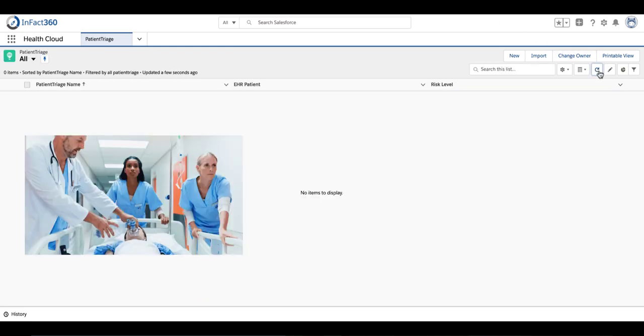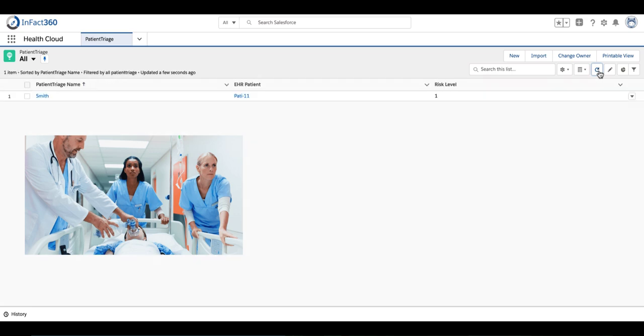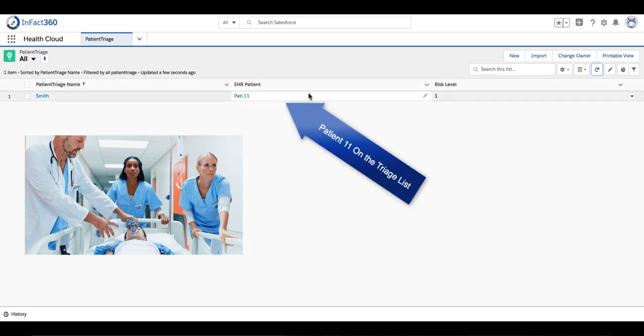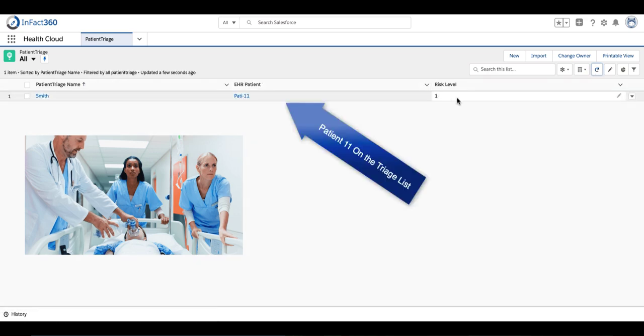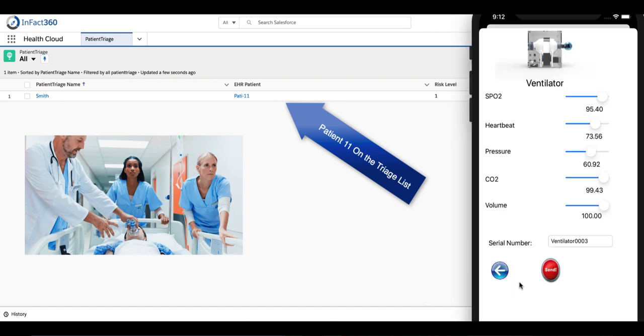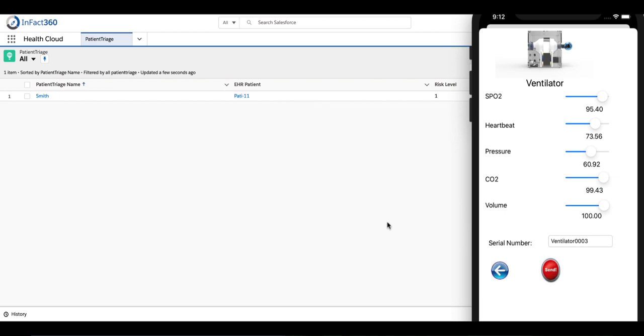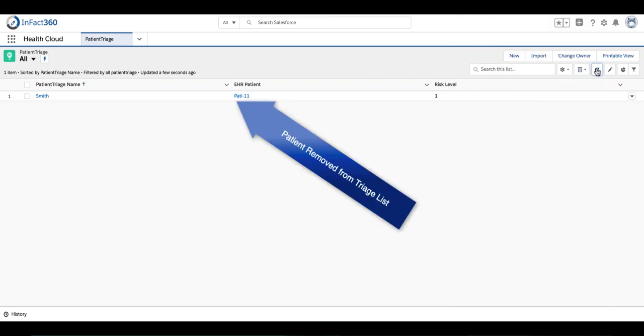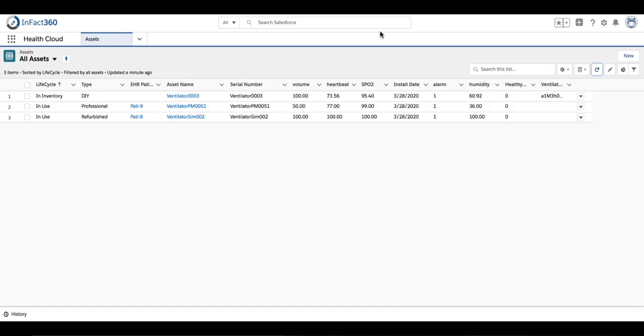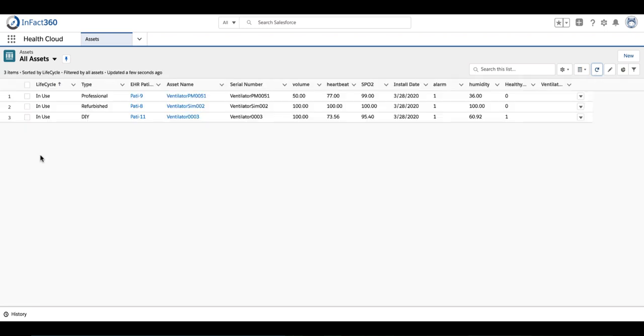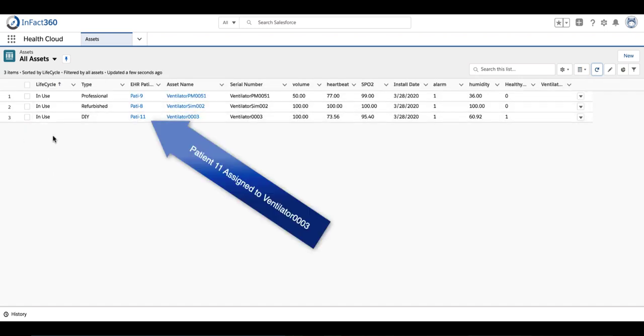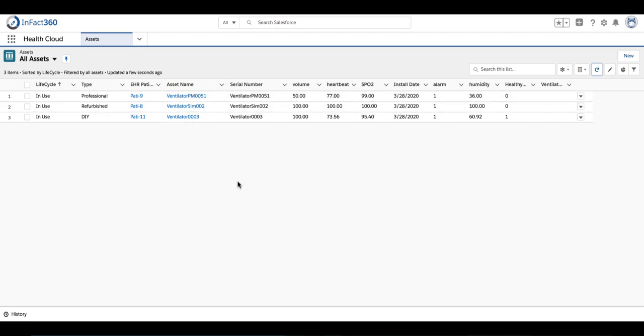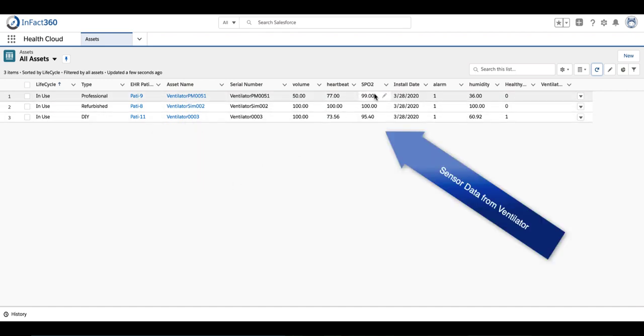As soon as they're in the patient triage list and a healthy packet comes in from an operational do-it-yourself machine, it's going to automatically assign that working, healthy machine to a sick patient. You'll notice that the asset record goes from in inventory to in use, and it's assigned to patient 11. All the other pertinent sensor data is being added to that asset record.